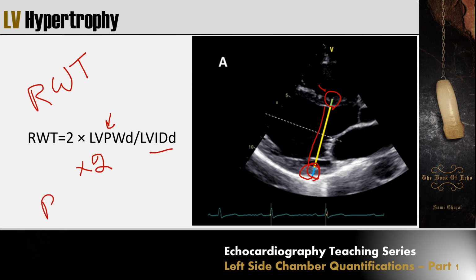This is how we get the relative wall thickness, and we need to memorize it very well.